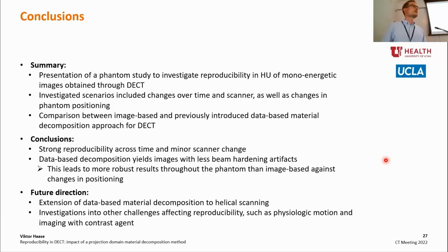Because I'm asking, yesterday we heard a talk about temperature estimations through CT, and it was claimed that you need to have dual energy CT in order to get good density values. And now you claim a similar thing, and I believe that you can get a good density value also with single energy CT if you do the corrections very well. And I'm still not talking about these beam hardening artifacts. That's a different issue. But if I want to compare how to reproduce density values or how a temperature slightly changes the density, I'm not convinced that you really need to have spectral information. So it would be interesting to see if your beam hardening correction might help and to also do this for a single energy. Yeah, I agree. Nice work. Thank you.